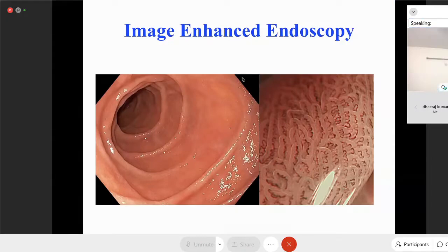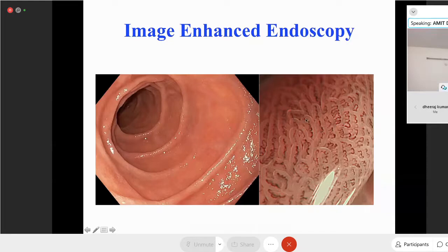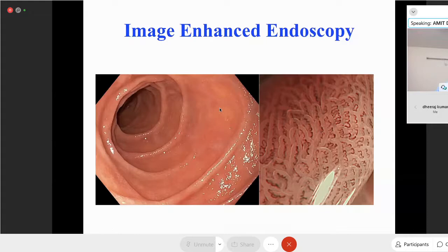When we say image enhanced endoscopy, what do we mean? If you look at this image of the duodenum with white light, you can see the mucosal fold and the surface appears flat. But when you apply image enhancement, you can actually see individual villi and even the blood vessels. By applying image enhancement, you see the surface in much more detail than with white light, giving you an opportunity to pick up lesions in real time, even before taking biopsies, to target areas that look abnormal.